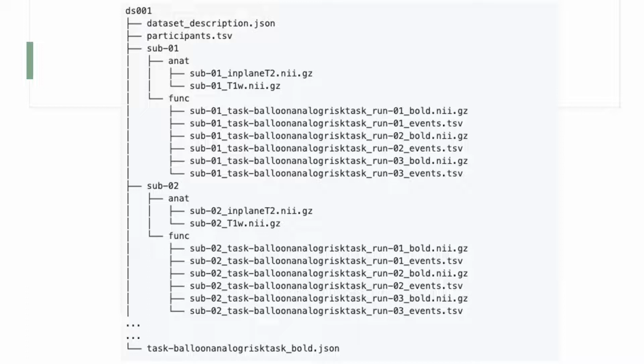And these sequence parameters are used by BIDS apps to run automatic pre-processing, so to speak. You can see how automatic it is in a bit, but the main difference between just running a DICOM to NII conversion and storing the NIfTI files that we often use for fMRI is that you also have these JSON files that contain the sequence parameters and whatnot.